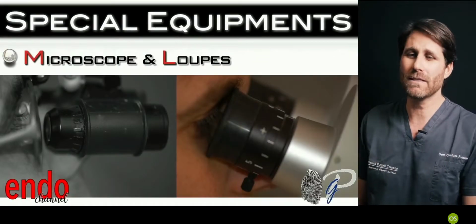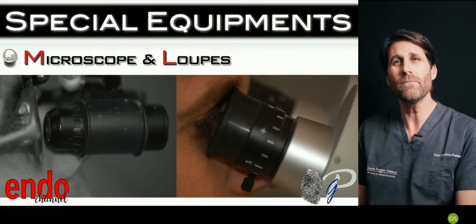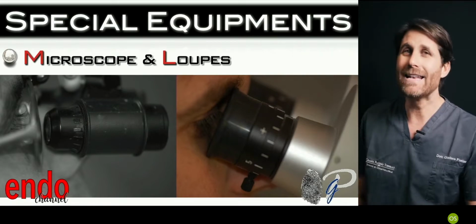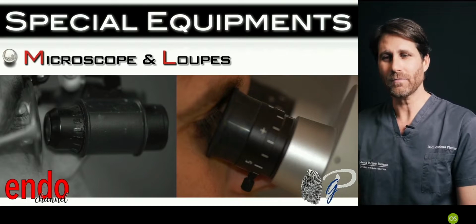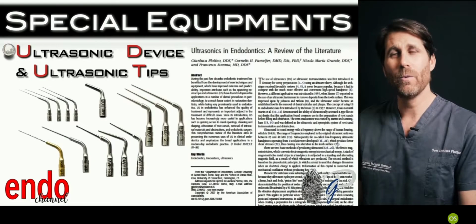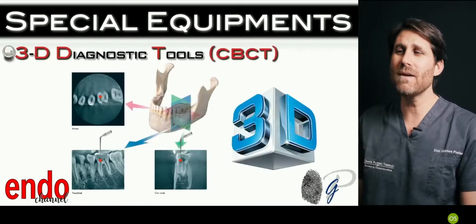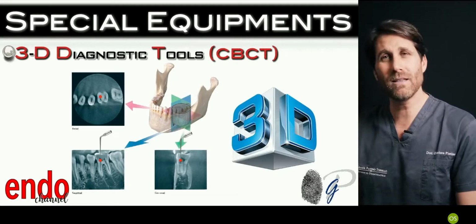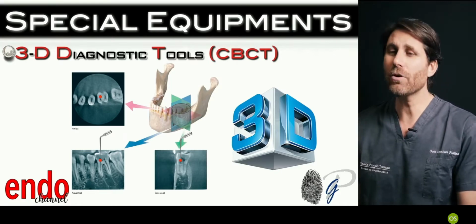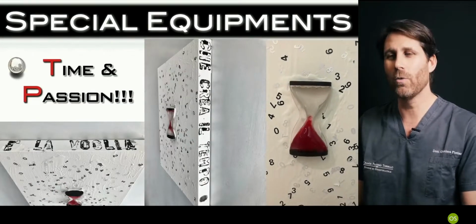So for the special equipment, we need a microscope and loupes. I like to say that I always start with my loupes at 4, 5, 6 times magnification, and then I use the microscope when it is needed. Then we use an ultrasonic device and ultrasonic tips. We have seen in this lesson how to use them. And we take advantage of a three-dimensional diagnostic tool like the CBCT that can guide us in our treatments. But the most important special equipment is our time and our passion for the work that we are doing.